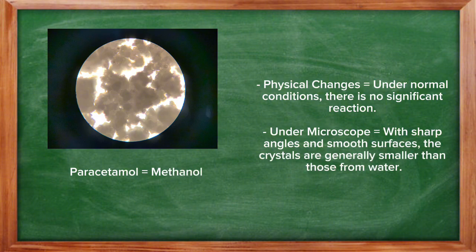In physical changes, under normal conditions, there is no significant reaction. Under the microscope, with sharp angles and smooth surfaces, the crystals are generally smaller than those from water.